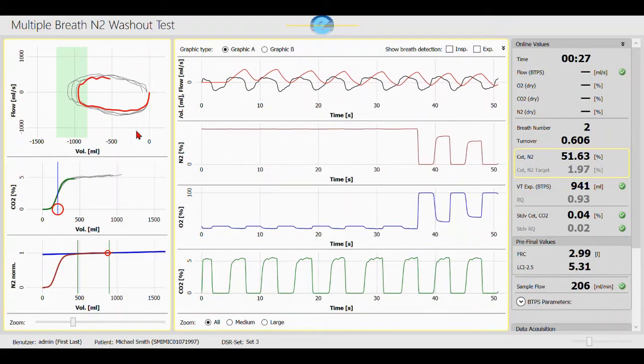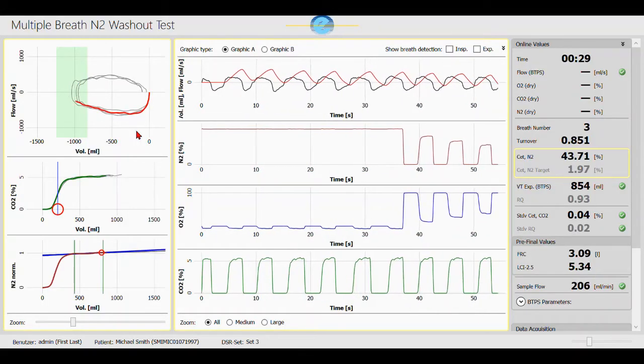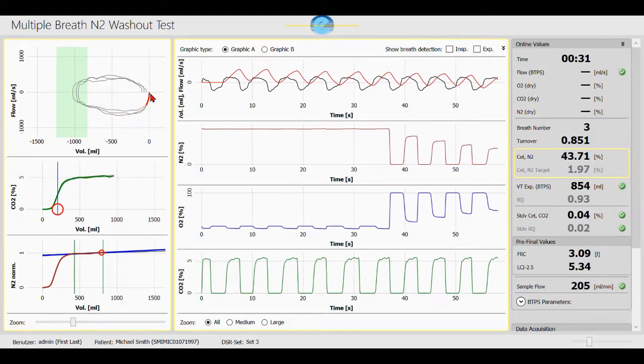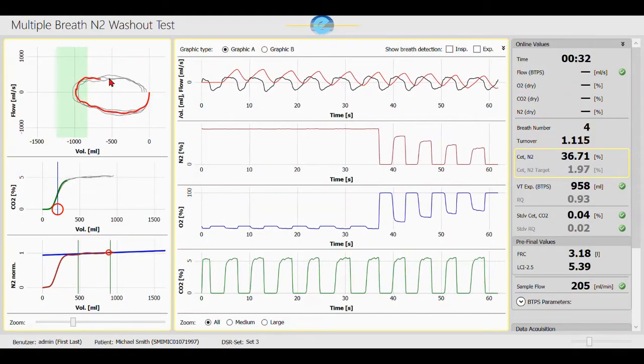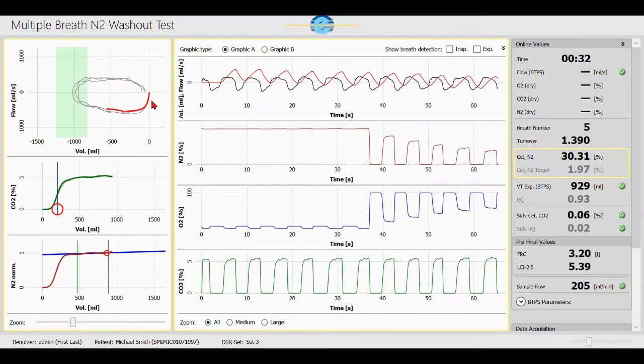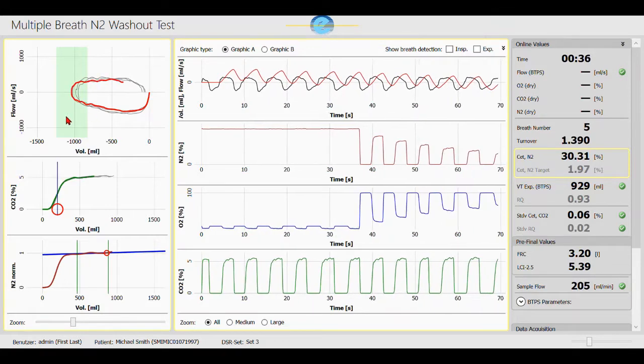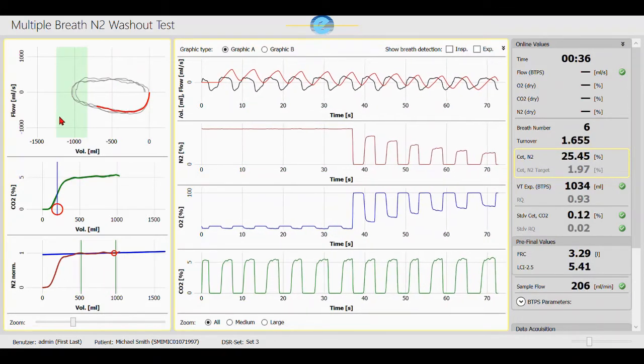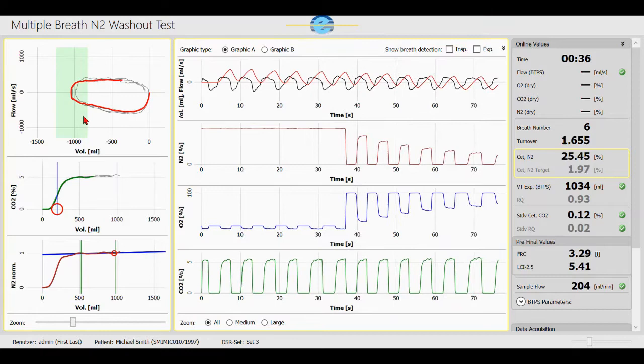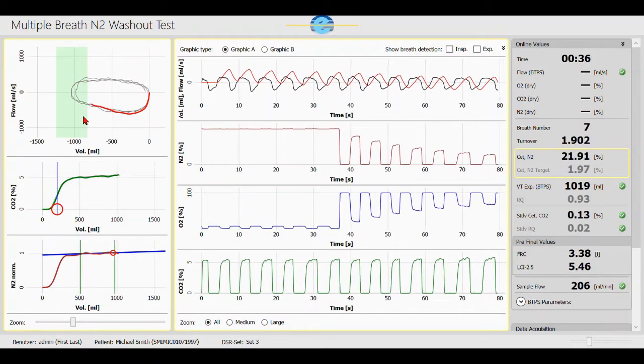During the washout, we can follow the progress in SpiroWear software. On the left, we have the flow volume loop. The flow volume loop should close, indicating regular breathing. The green area is a visual guidance in which predicted range the subject's tidal volume should be in.